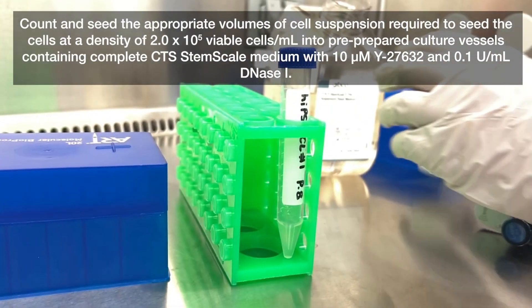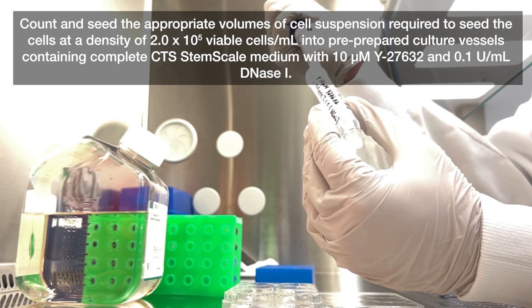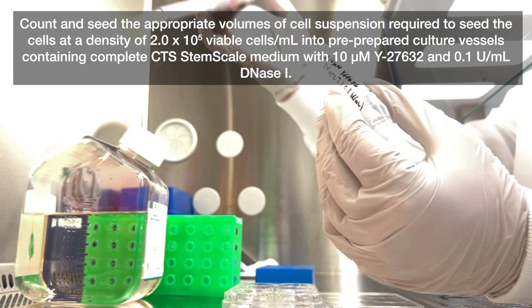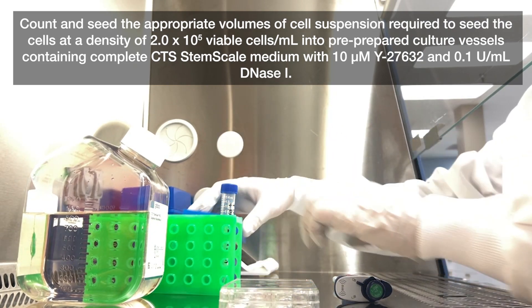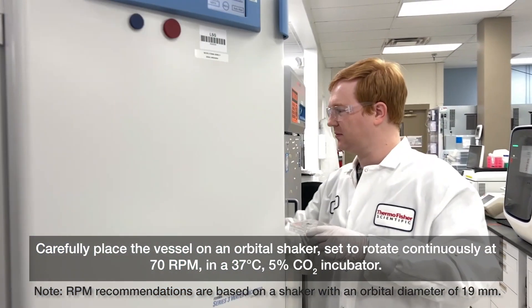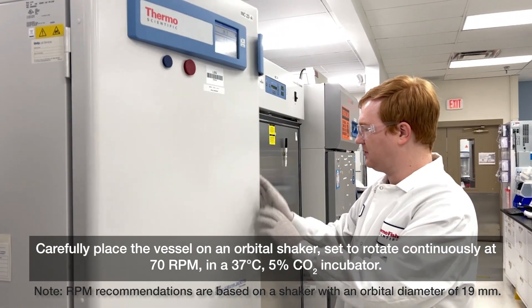Count and seed the appropriate volumes of cell suspension required to seed the cells at a density of 2x10⁵ viable cells per milliliter into pre-prepared culture vessels containing complete CTS StemScale medium with 10 micromolar Y27632 and 0.1 units per milliliter DNase 1. Carefully place the vessel on an orbital shaker set to rotate continuously at 70 RPM in a 37 degrees Celsius, 5% CO2 incubator.